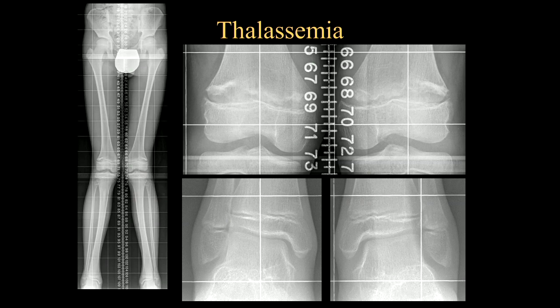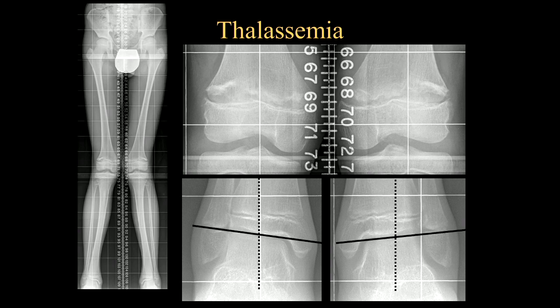Finally, here's a patient showing the growth disturbances that are very classic in patients with thalassemia. Looking at these leg length views, you can see much irregularity of the distal femoral metaphyses, slanting of the ankles, and looking at the overall orientation of the legs, there is a genu valgum as well as ankle valgum.